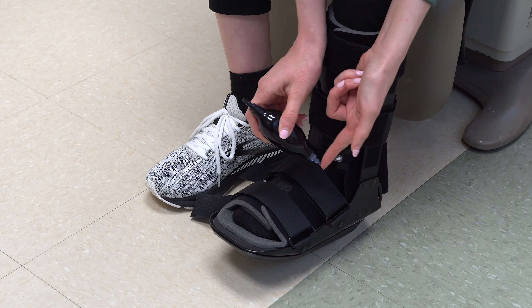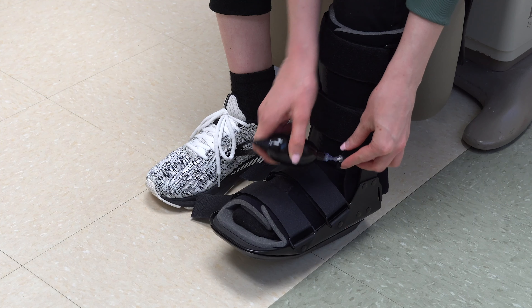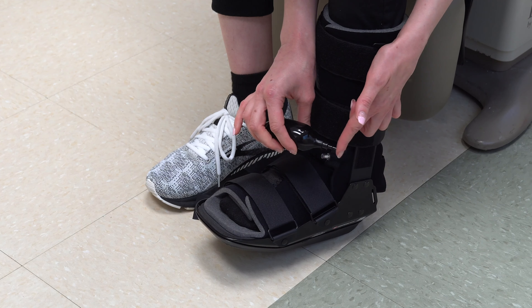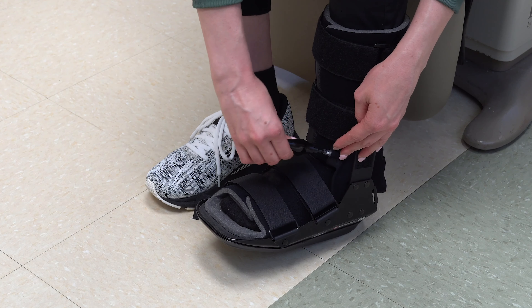To inflate the bladder, attach the clear nozzle on the pump to the clear nozzle on the bladder. To deflate the bladder, attach the black nozzle to the clear nozzle on the bladder.